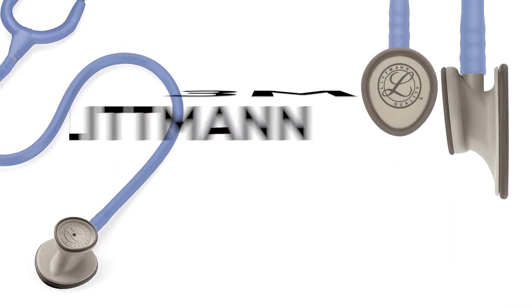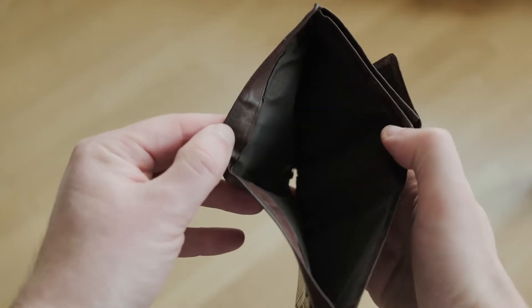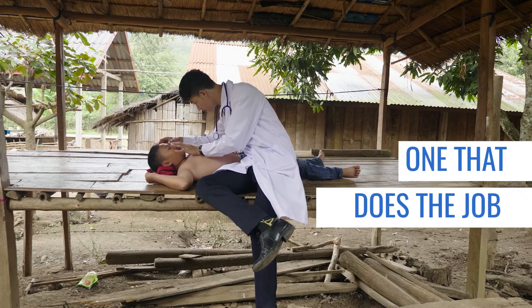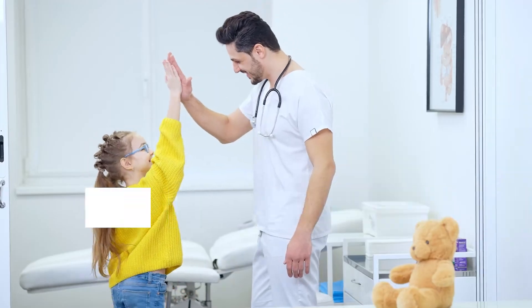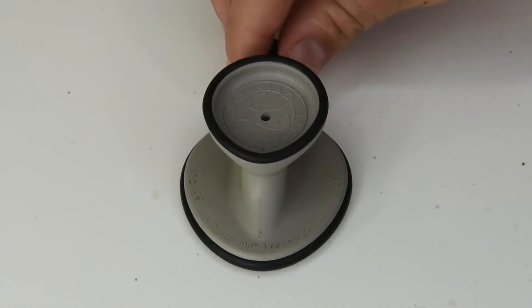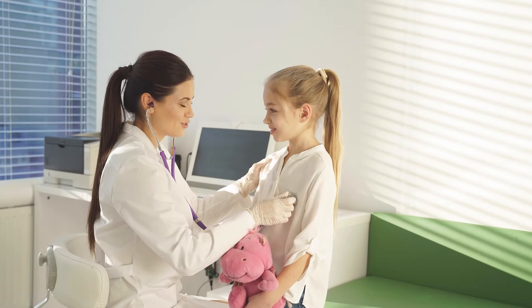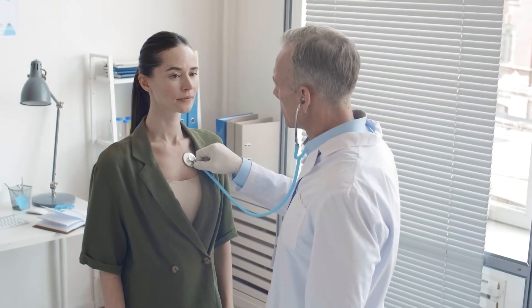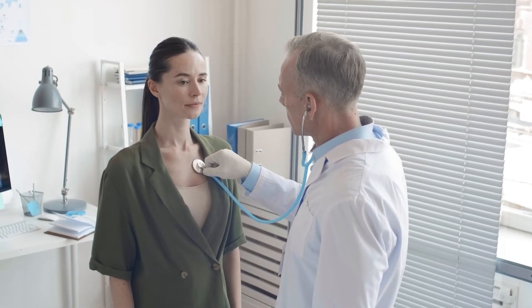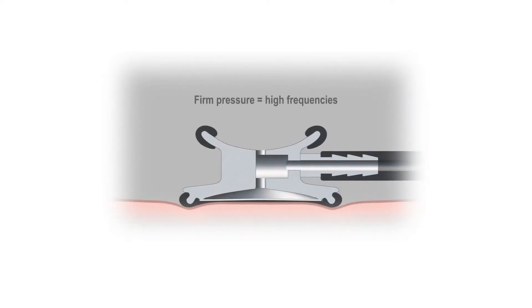Third, the 3M Littmann Lightweight II SE Stethoscope. If you're on a tight budget but want a stethoscope that does the job and does it well, then try out the Littmann Lightweight II. Its dual-sided chestpiece is designed to provide solid acoustic performance for both paediatric and adult care assessments despite its lower cost. You can also tune the diaphragm when listening for low and high end frequency sounds by simply applying pressure on it.